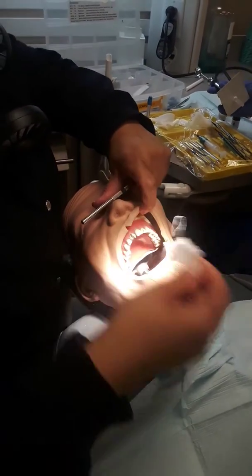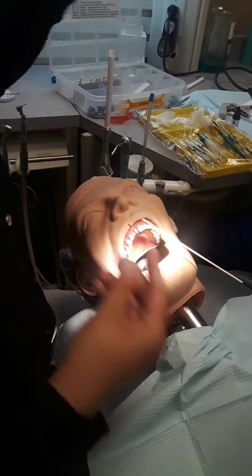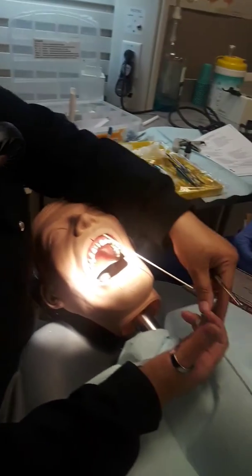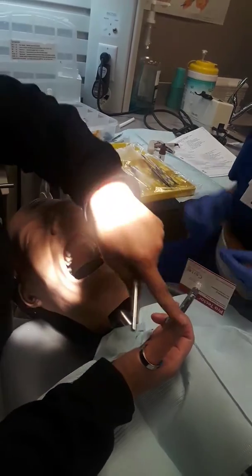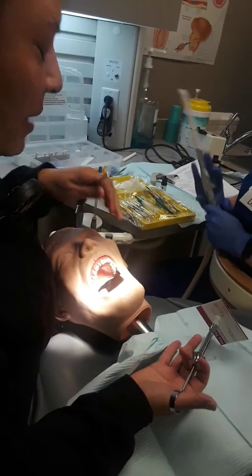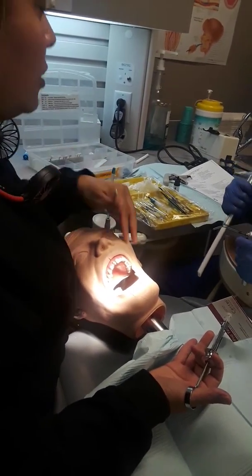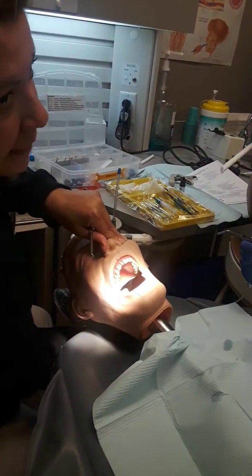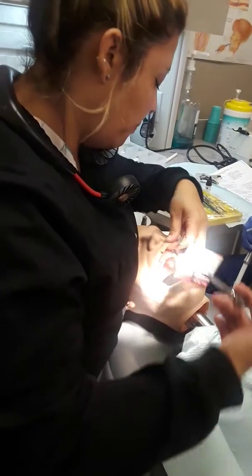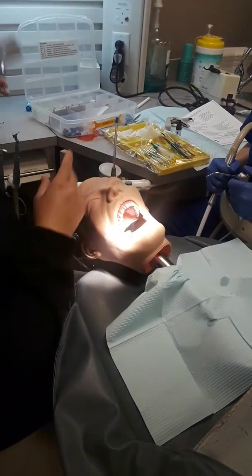Step two: dry the buccal mucosa — that's what the gauze is for. Wipe that area, put topical gel there. She glided the syringe on my hand, put it on my thumb, and waited until my hand was in position. I keep it low on the patient's chest so it doesn't go in their eyes. We load it on their hand and keep it out of the patient's view — we're going to shake the lip to distract them while we give the anesthetic.